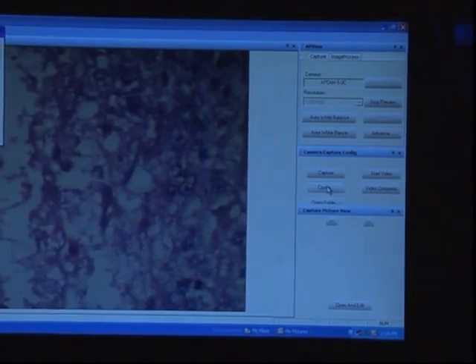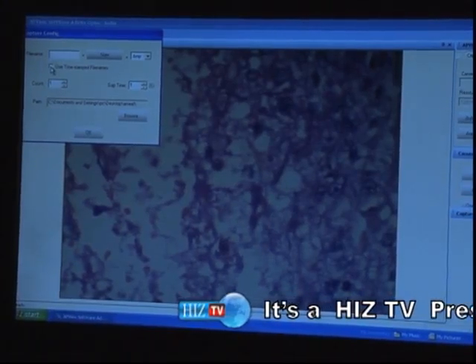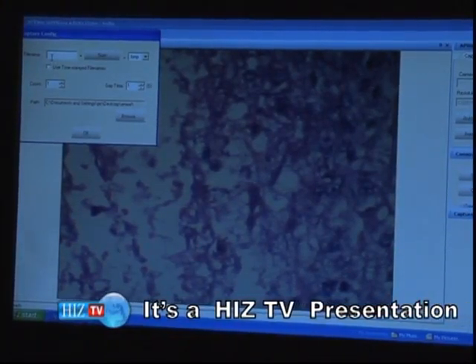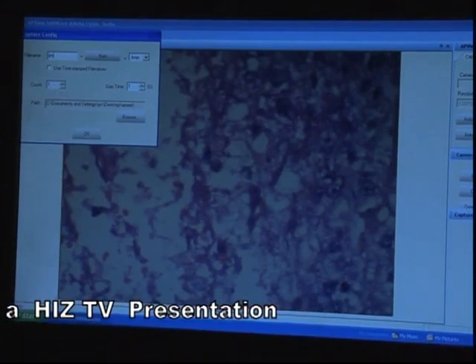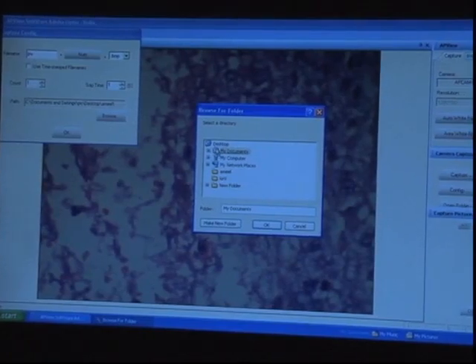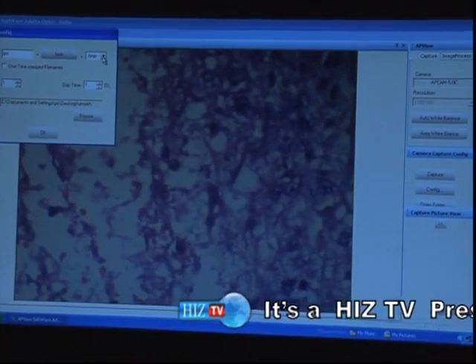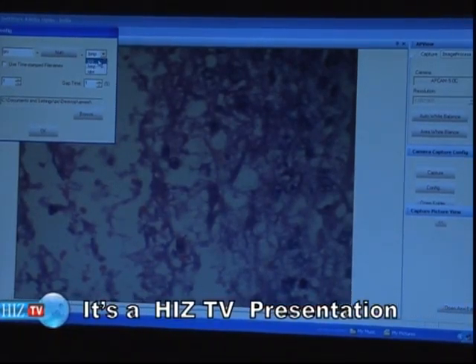Frequency can be set to 50 Hz or 60 Hz depending on the frequency range. In the configuration option, we can set where our images are being stored. We remove the tick mark, give the file name whatever we want, and choose the option where we want to save our images. The image type is usually changed to .jpg. In the image process option we have the following options: crop, mirror, invert, lift, rotate, sharpen, lighten.